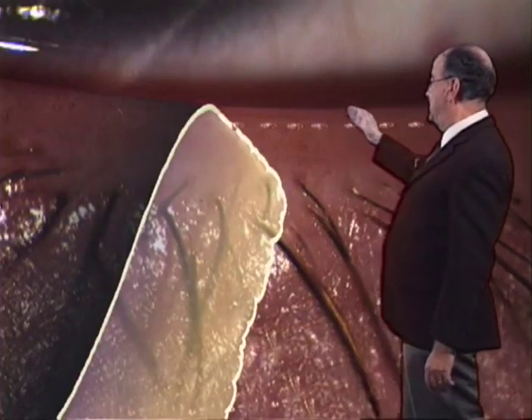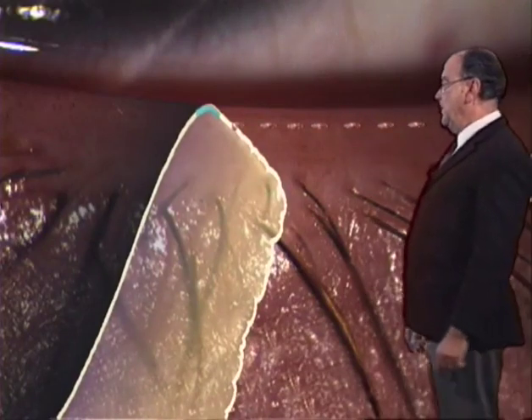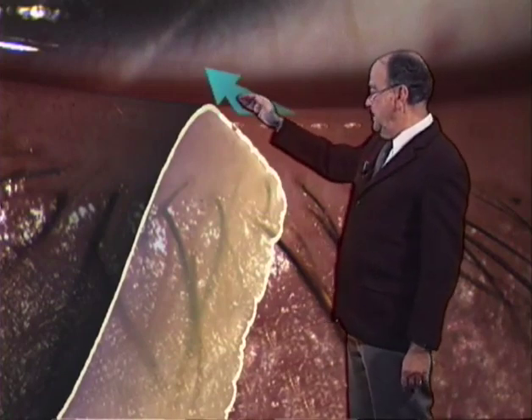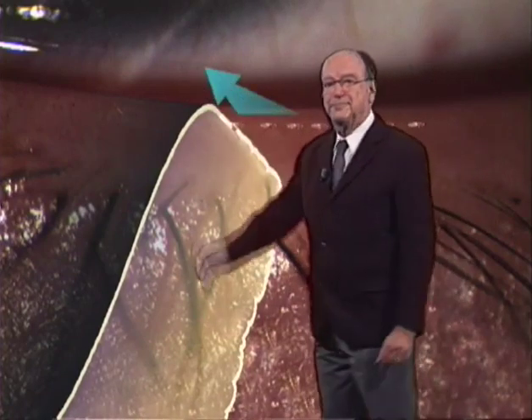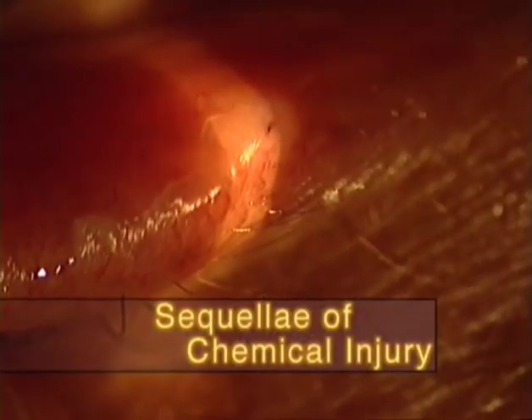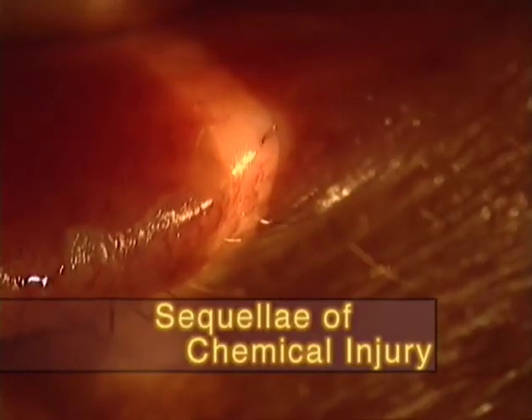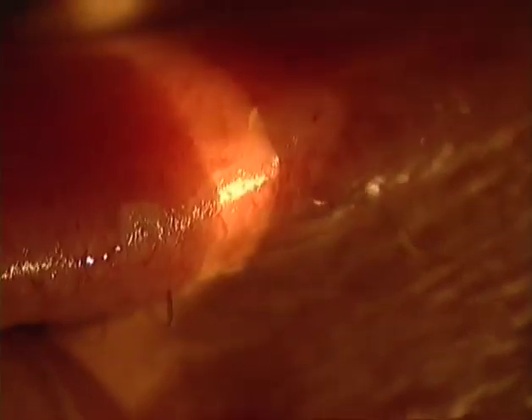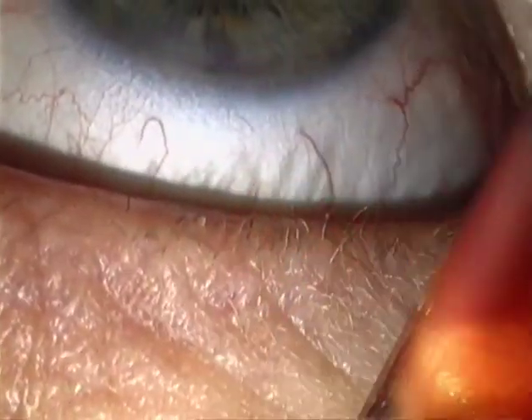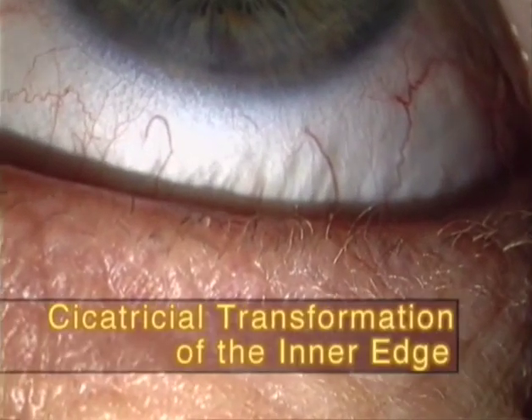Tissue transformations affecting the inner edge may bring pathological particles and secretions in contact with the tear film and the globe. Major tissue transformations, such as the sequelae of a chemical injury, are easy to diagnose. The mechanical impact of the sharp-edged exuberant keratinization as a cause of severe damage to the globe is evident. But in many cases, the tissue transformations causing discomfort are subtle.